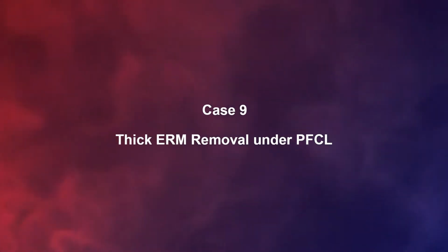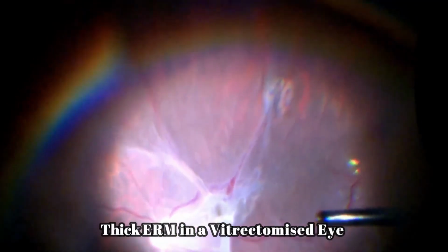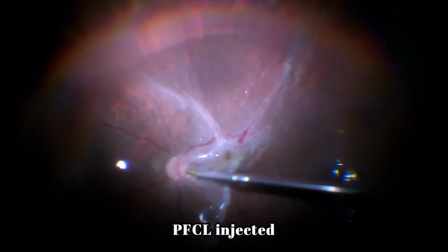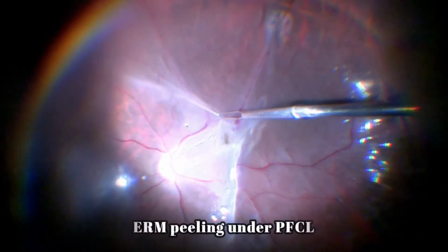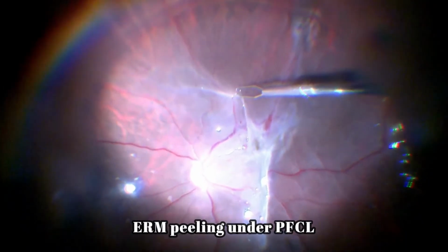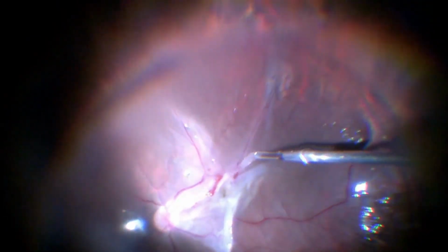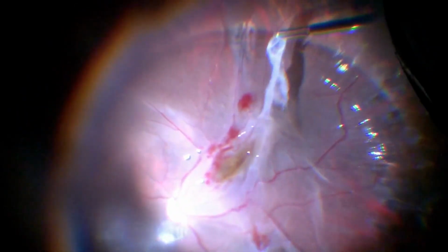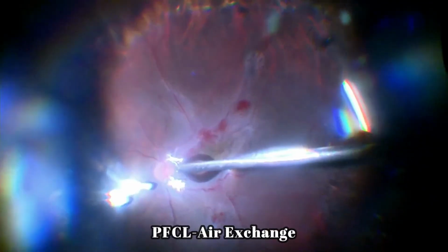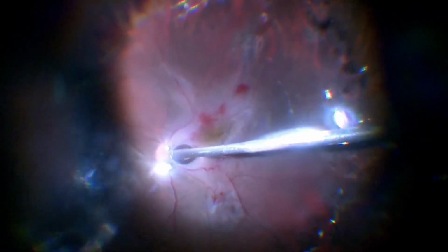In this case, the case began with injection of PFCL, which was used to stabilize the underlying retina, followed by epiretinal membrane peeling under PFCL. PFCL air exchange was carried out at the end of the surgery.